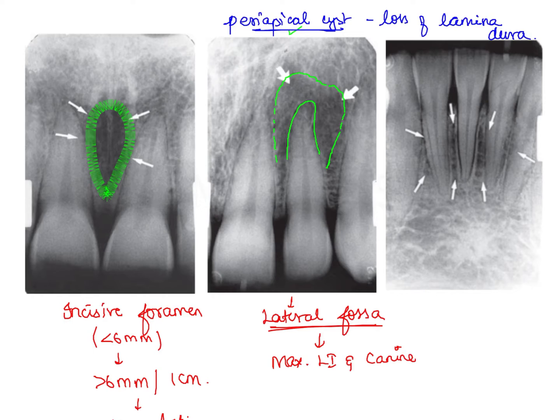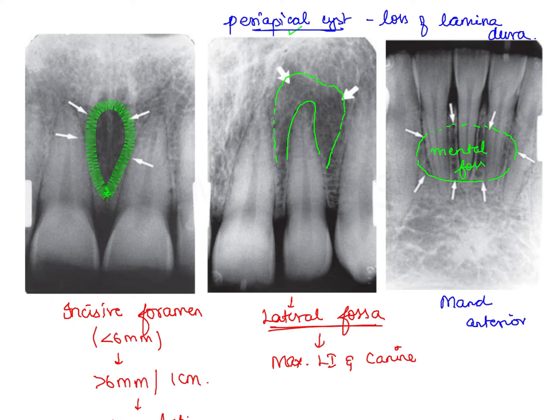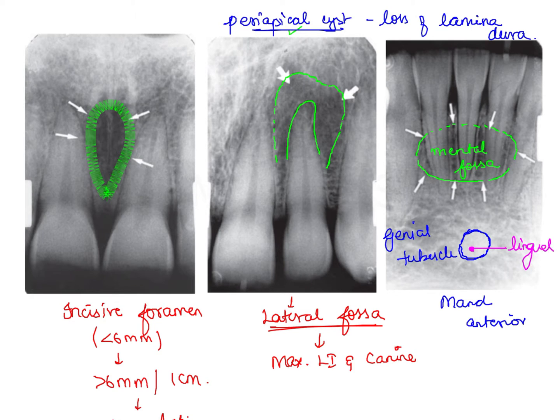Moving on to the third image showing the mandibular anterior region — this is the mandibular anterior IOPA. There is an ill-defined radiolucency, which is the mental fossa. In the same radiograph, we can also find a radio-opaque structure known as the genial tubercle. In the center of the genial tubercle, there is a small radiolucency denoting the lingual foramen.